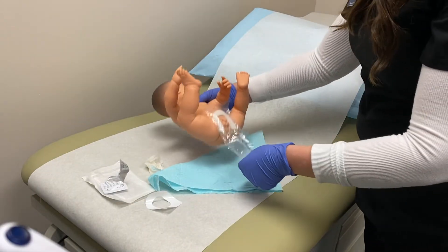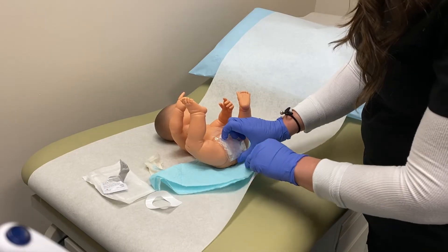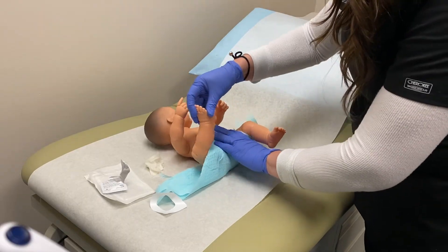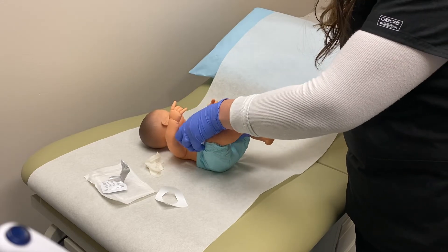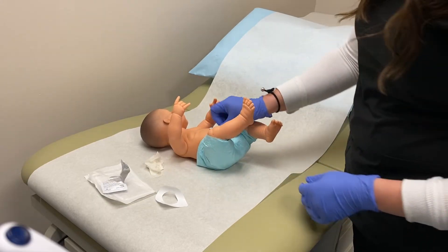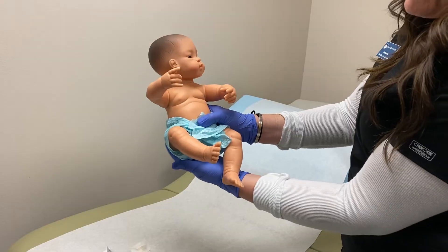Once you are done placing the bag, sometimes you might need to fold it up just a little bit. You'll put a clean diaper on the baby — put his diaper back on, put his little legs down. Once he is diapered again, you can also have his parents put his diaper back on if they're there and they would like to. The diaper is going to sit on top of that U-bag.